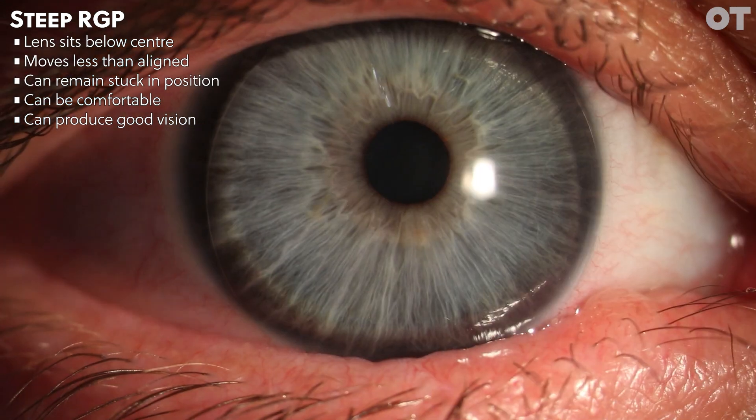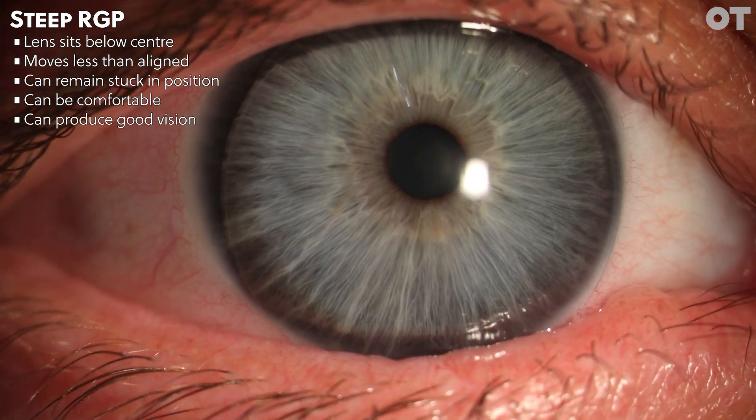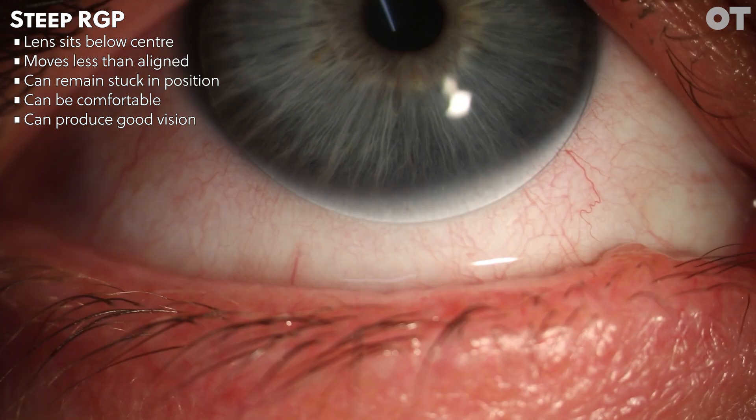Vision can be relatively good; however, if you need more minus in the over-refraction than expected, this can also indicate a steeply fitted contact lens.